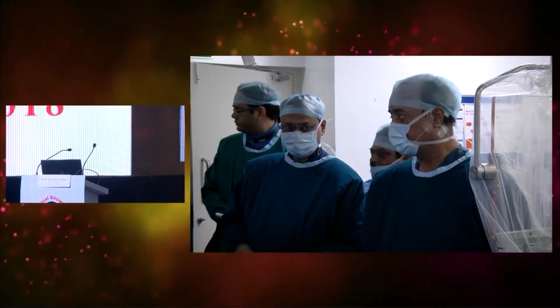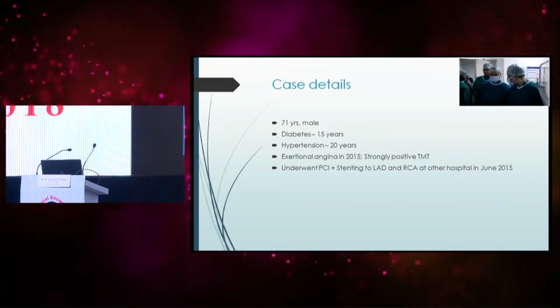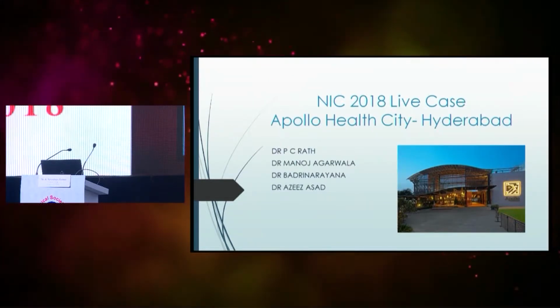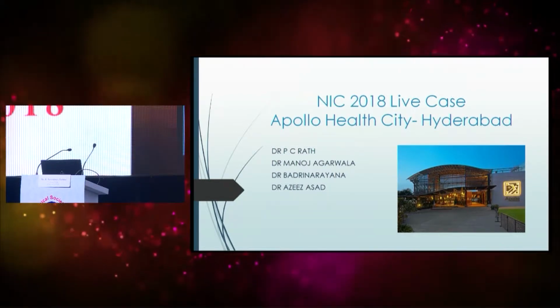Our first case with me is Dr. Manoj, Dr. Badri, Dr. Aziz. And for the OCT expert, we have Dr. Akash from Japan. He is the authority on OCT. We have this left main case. I'll ask Dr. Aziz to present the case.